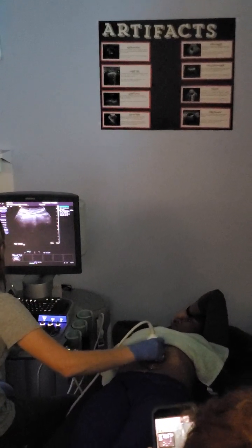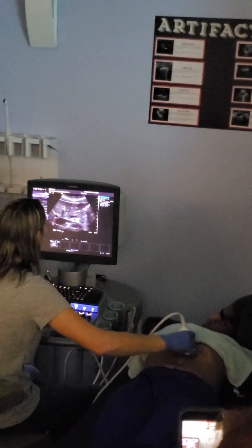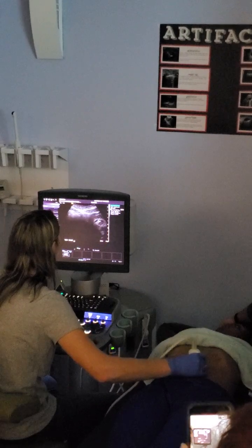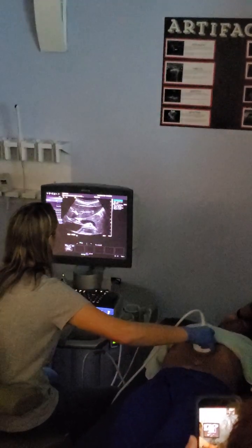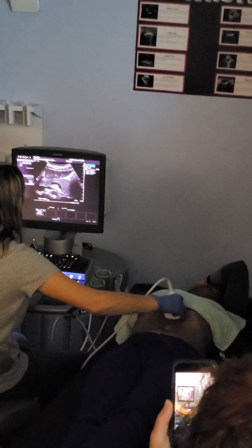Okay. Go ahead, big breath in and hold it. So notice again that I'm angling through that liver window. If I come down onto her pancreas, see how gassy things get? So you may have to go below the gas and scan up. It doesn't work for her. But ideally, you want to go up on that liver and angle down. There's our 7 o'clock. We've got a nice, I'm just going to retake this because I printed.